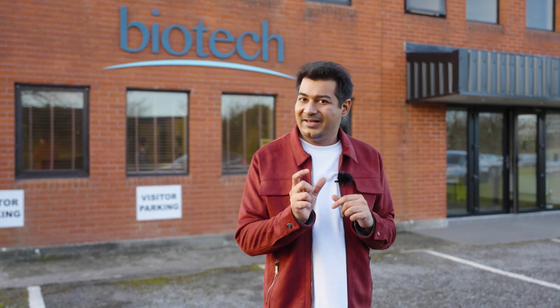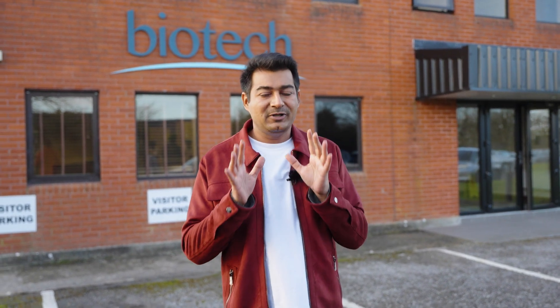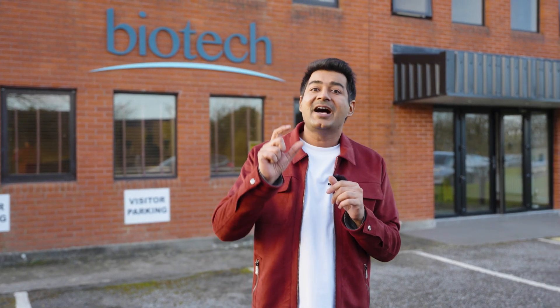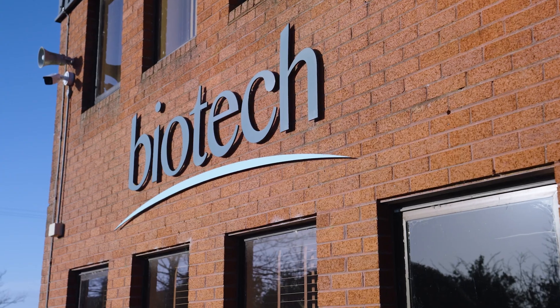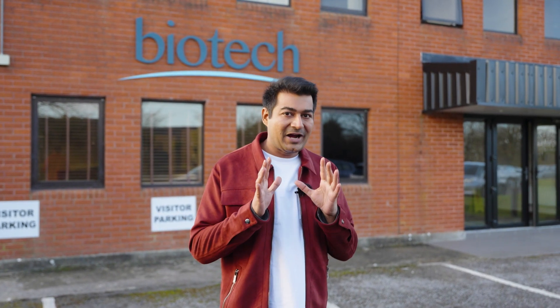I remember some time ago I had a minus 32 number of chashmets and I got a Limca record as well. That was possible only because the biotech company has the technology to design and manufacture such high-power phakic IOLs. So today I am here at ROSCOM and I am going to give you a complete factory tour.